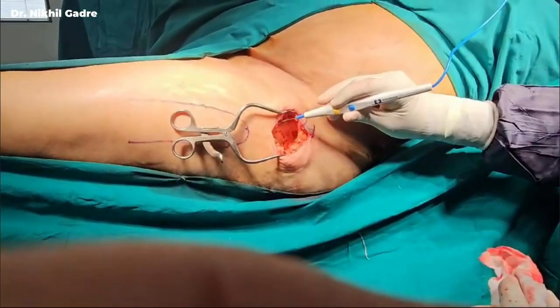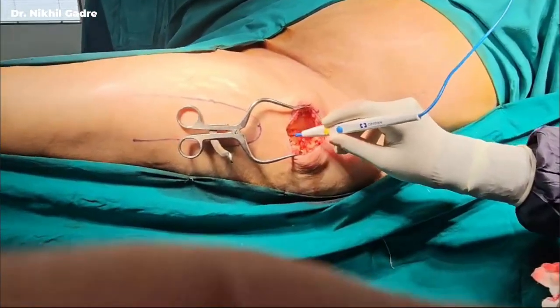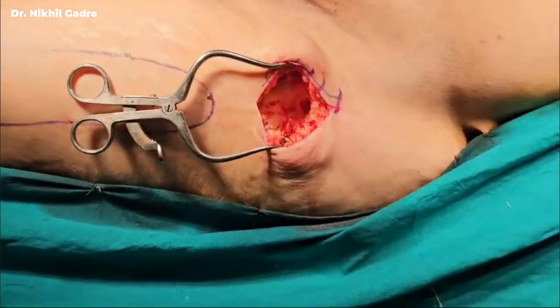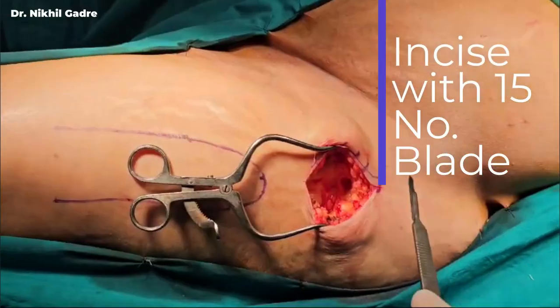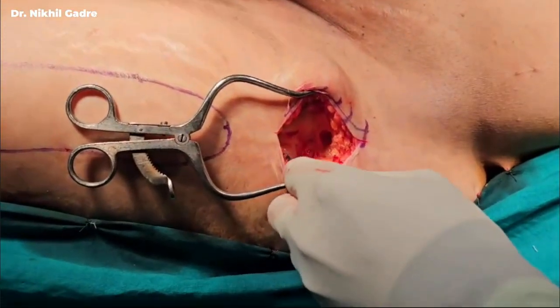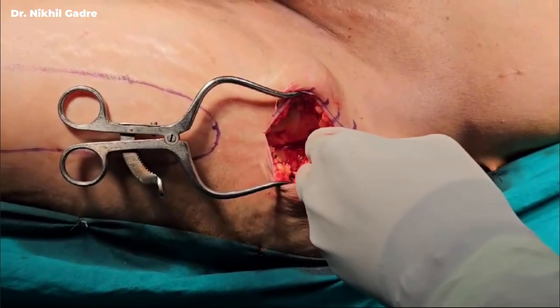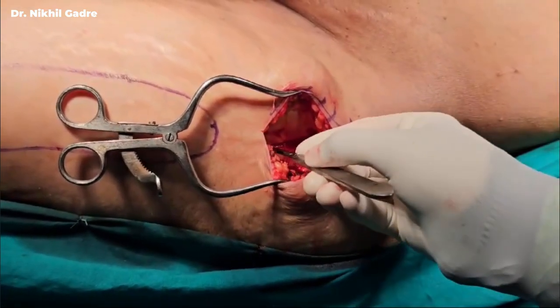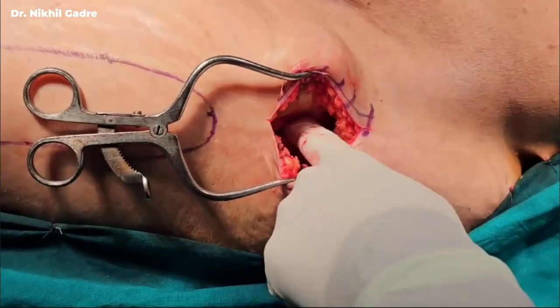Having incised the skin and subcutaneous tissue, we have exposed the TFL. Now we will incise the TFL. Be as gentle as possible. We will incise it with a 15 number blade. Just be gentle. We do not want to cause any traumatic injury to the underlying gluteal muscles. Gluteal muscles should be dissected blunt with the help of an artery forceps.